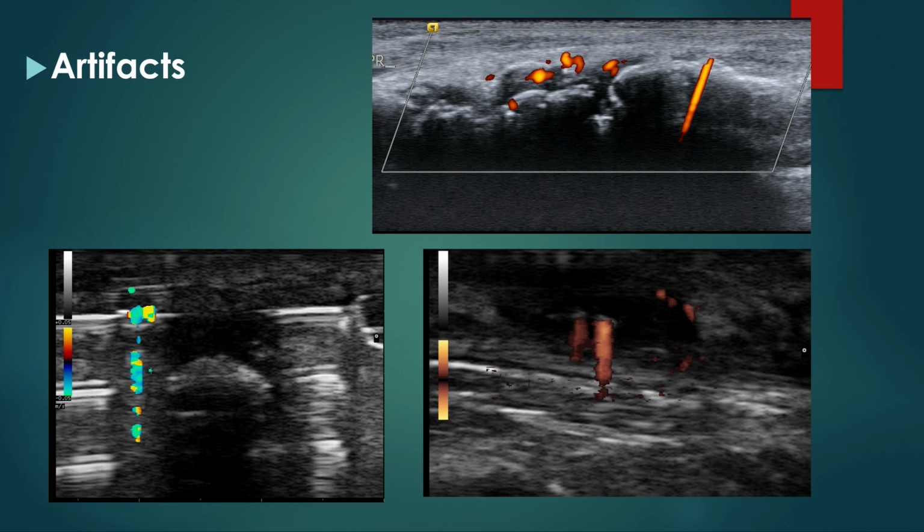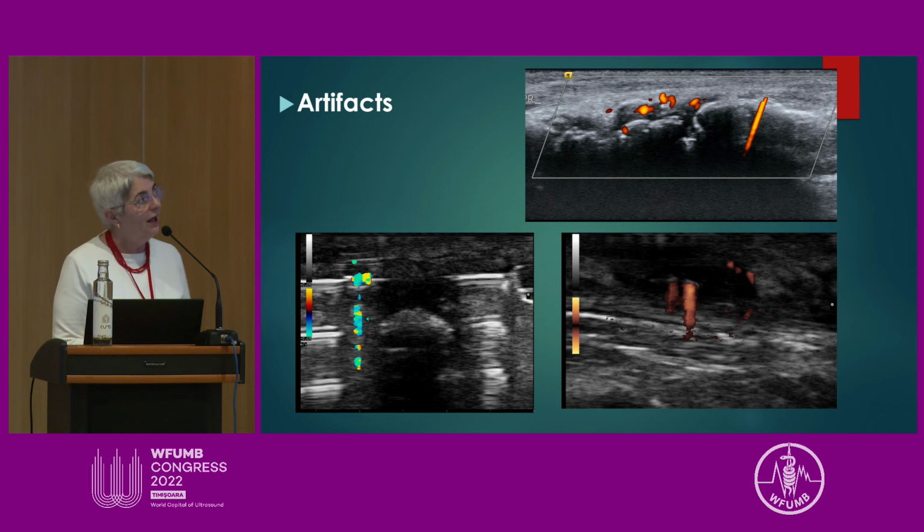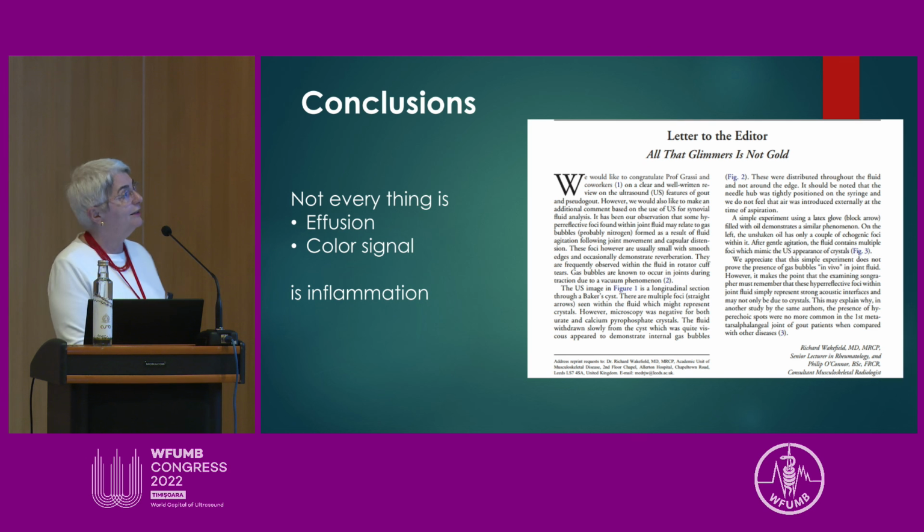And this is the classical image, and in the floor there are some people who came to us in Cluj, and they had to examine and characterize this image, and I asked them, what is this? Many of my students answered, a vessel, a vessel, a vessel. In fact, this is an artifact. And this is an artifact in a patient with rheumatoid arthritis with an active inflammatory wrist, so it's easy to interpret this image like a vessel. But of course, there is an artifact.